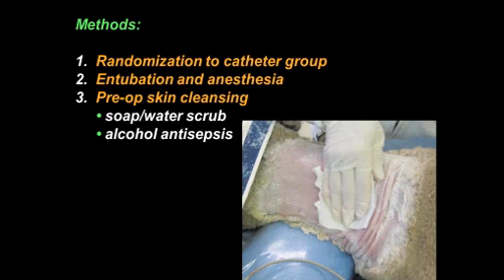In this case, we are going to be protective of the intraluminal surface. I'm also testing the efficacy and the ability of this chlorhexidine acetate coating to prevent colonization of the catheter. While we were very protective of the skin and the extraluminal surface in the last study, this time I'm not going to give the catheter any help. There will be no chlorhexidine, no antiseptic used, because I am testing the efficacy of the coating.